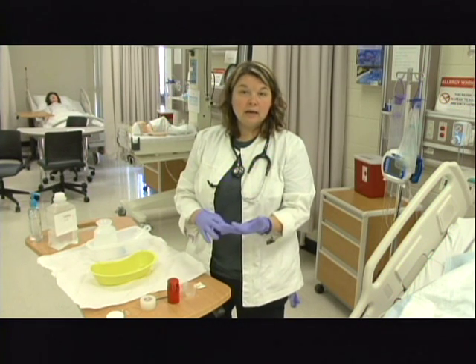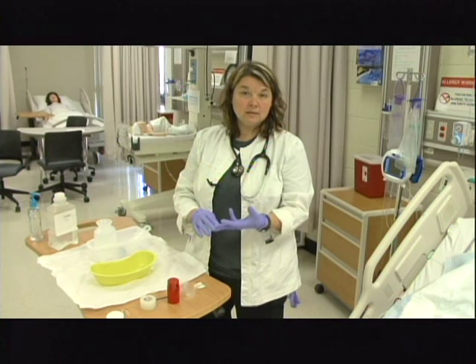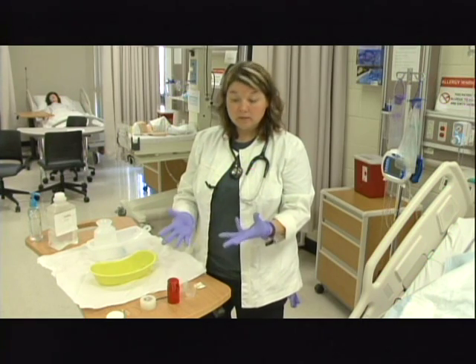You need to check your drug guide or check with your pharmacy or whatever reference you have to make sure that it's okay to crush the pills. You do not want to crush any that are sustained release or extended release or any of those types of things. If you can get them ordered as liquid, that is probably the easiest way to do it.